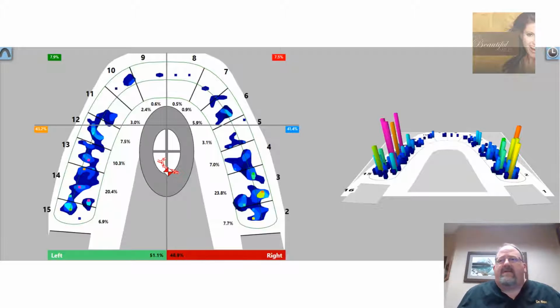So a patient comes in, they get all the traditional stuff that dental offices are known for, like a cleaning, a perio-probing, full mouth set of x-rays, and then right at the end, we check their bite and see if there's any issues. Lo and behold, during the screening process, I do see a concern that alerts me, and I have a little candid conversation with the patient about bite force profile and what this T-scan technology shows us. What does it mean?